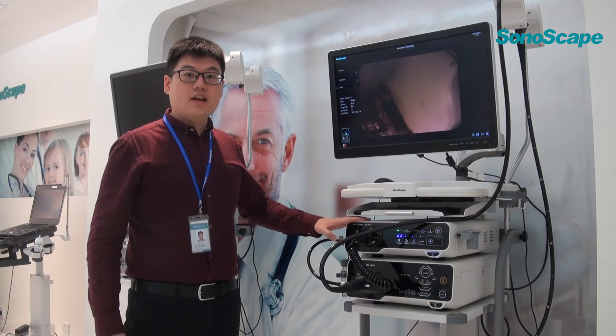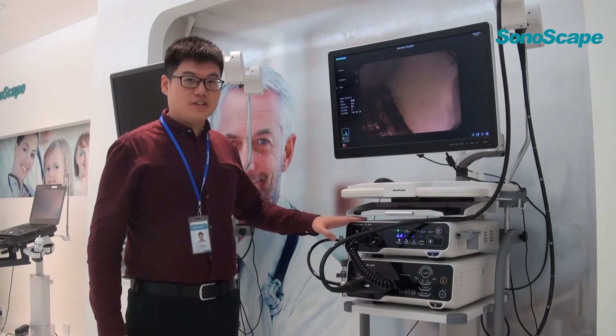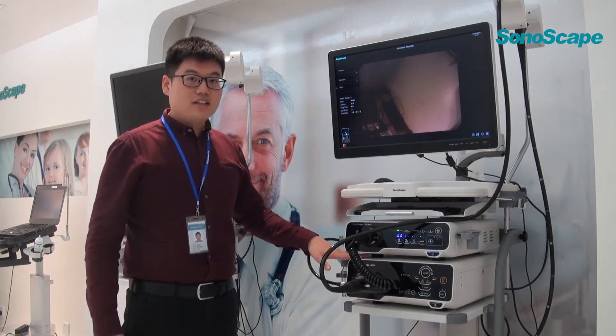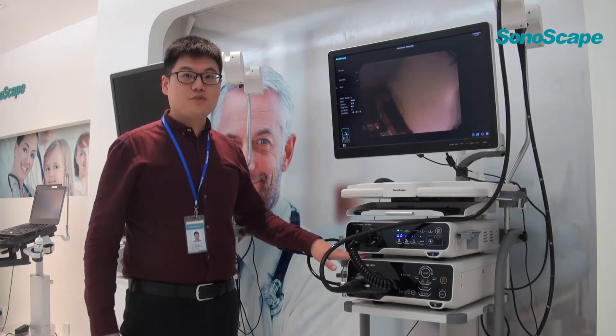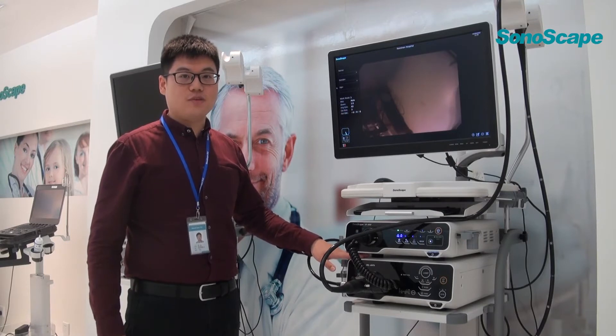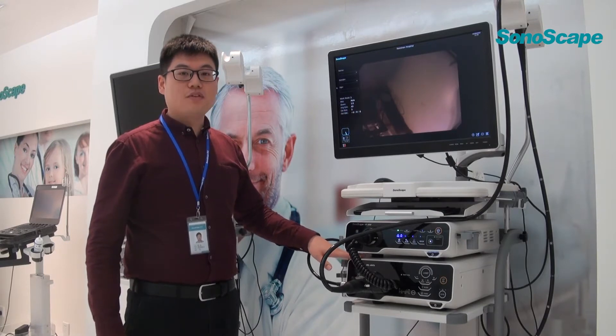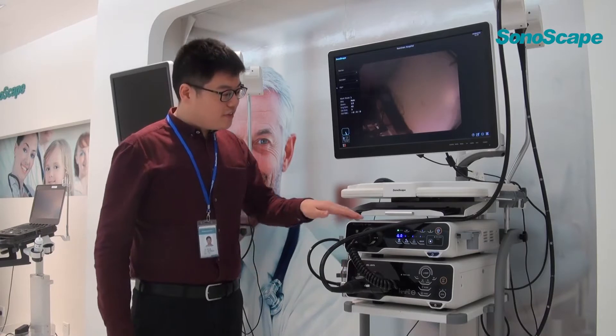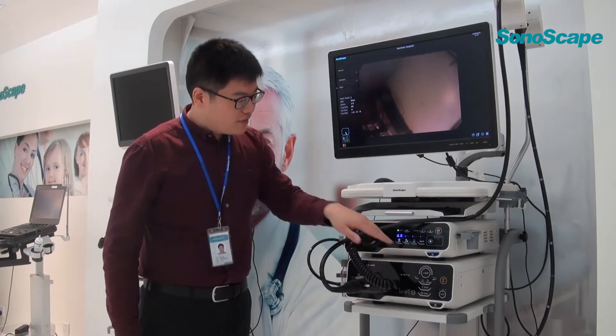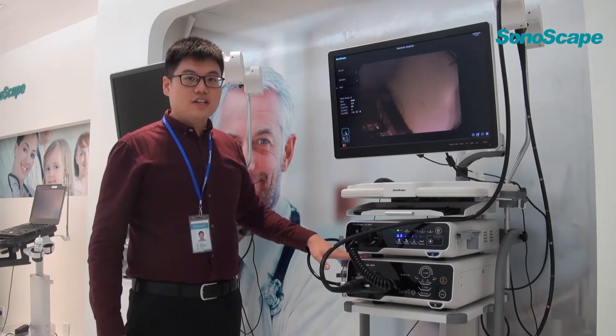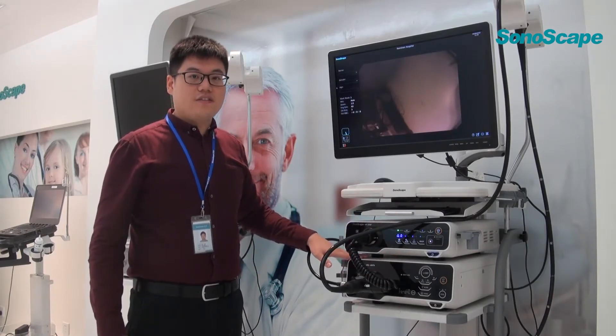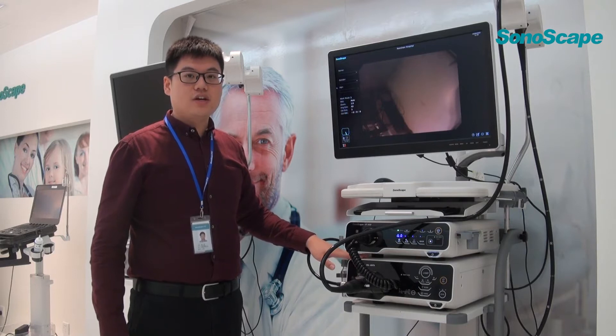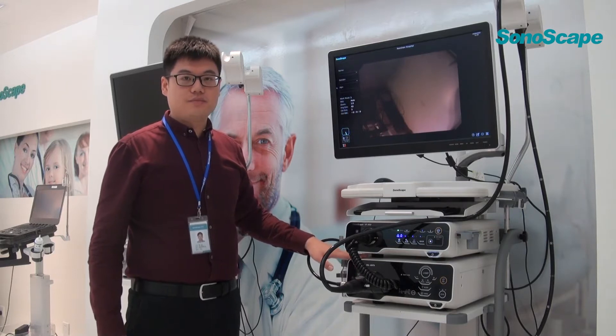And the third feature is about the light source. The light source was equipped with 300W Xenon lamp, can provide sufficient illumination. And the VIST technology is an effective way to detect the early cancer.